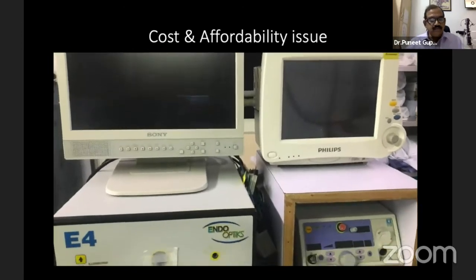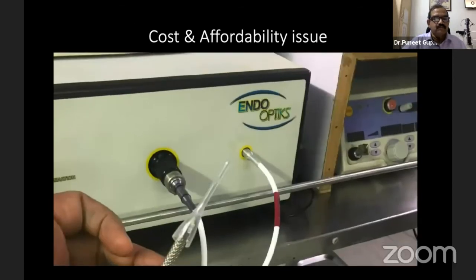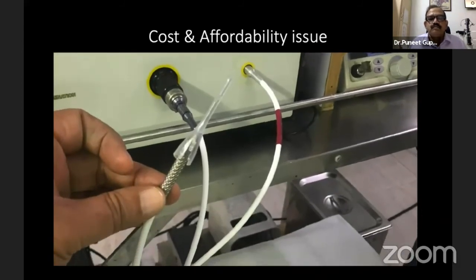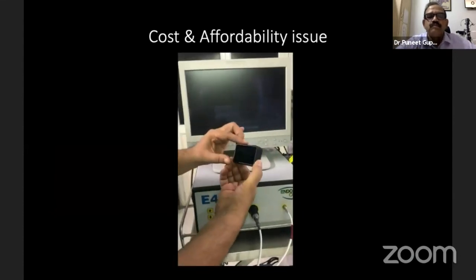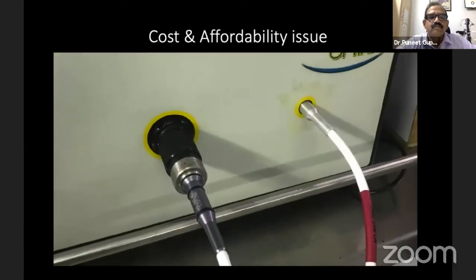A commercially available endoscopy system has a base unit and a monitor. The base unit has an illumination source, video camera, an interface for the fiber optic endoscope, and an optional laser photocoagulator. I present a feasible, cheaper, but more efficient approach for endoscopic surgery using a modified C-mount portable GoPro camera.